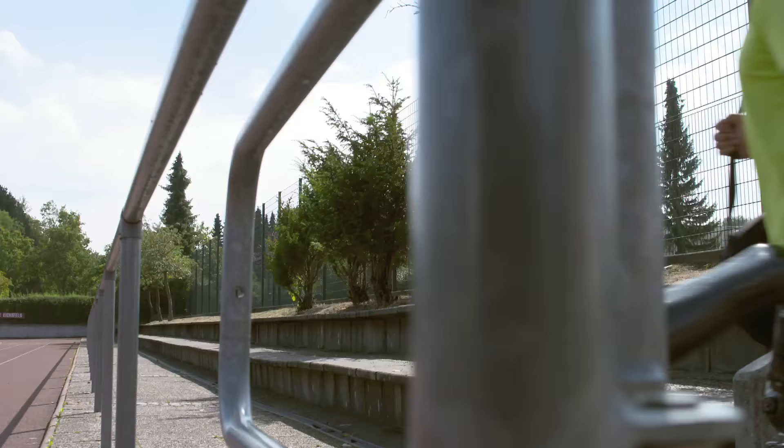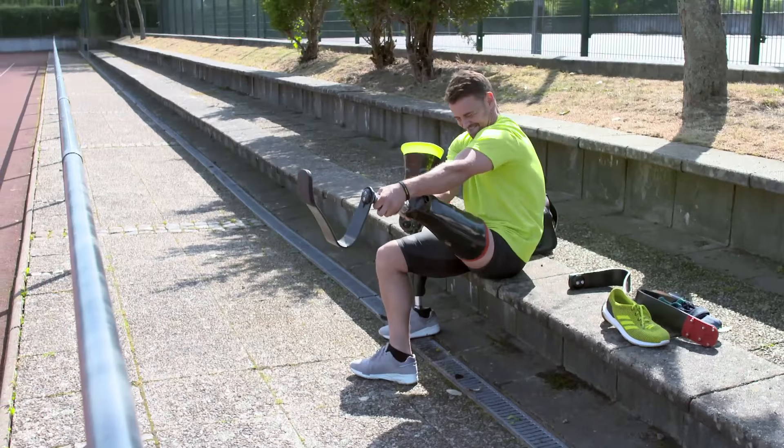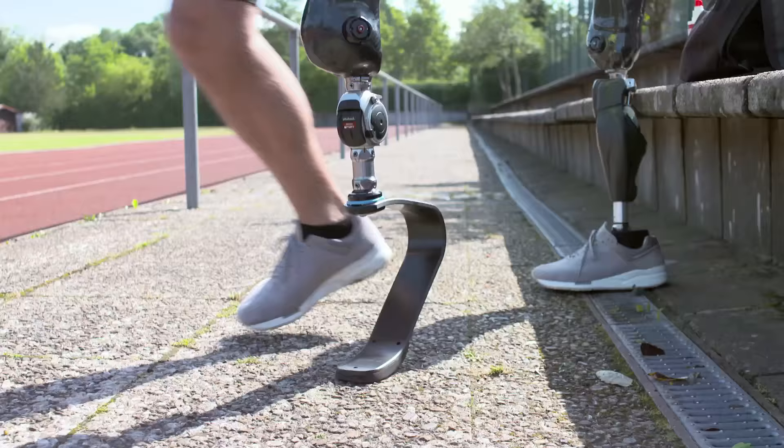For me to have a prosthetic that's especially made for me, it's like I'm getting my leg back again. Having a special prosthetic means it is working like I need it, and I will not have a fight against a prosthetic.